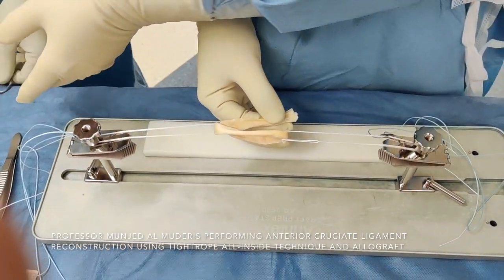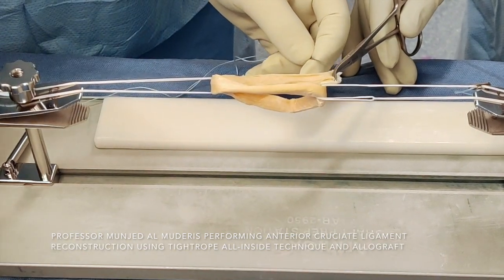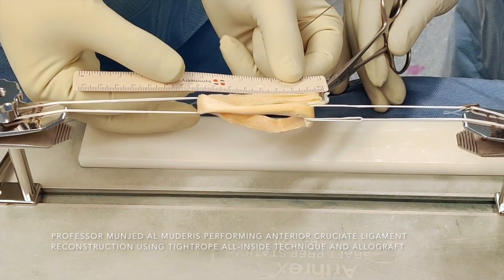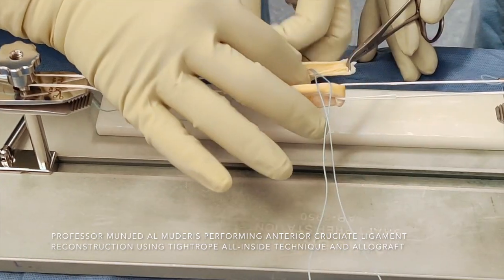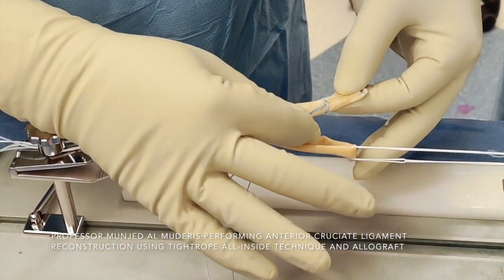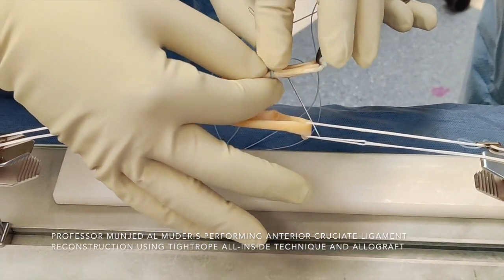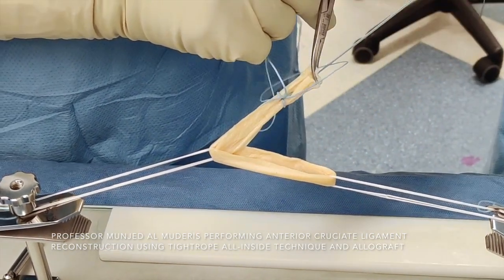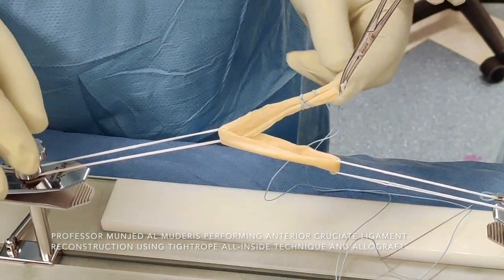I use an artery clamp to hold it together. I utilize a whipstitch suture to suture it together. I measure a distance of around two and a half centimeters from the tip where I insert my suture. I pass the suture through the middle and proceed from outside in with one go, skewing the internal part of the suture together.